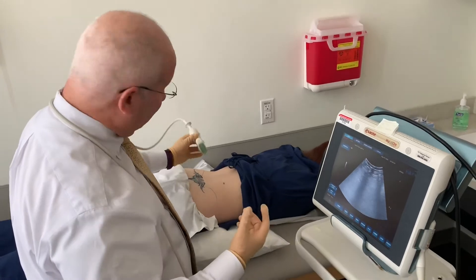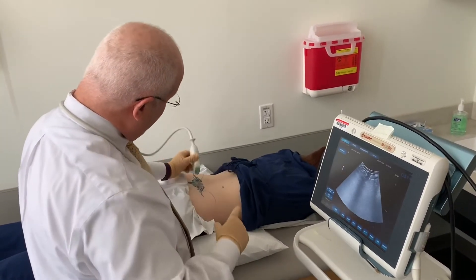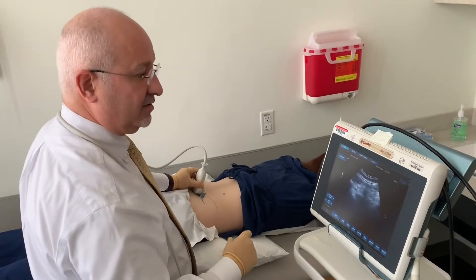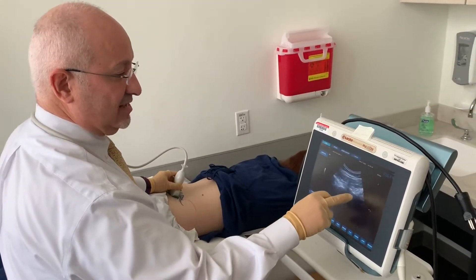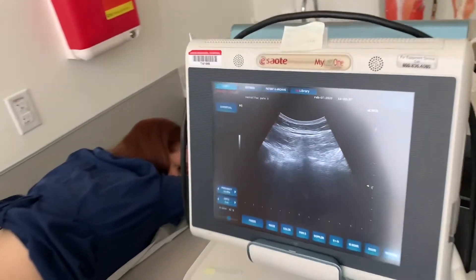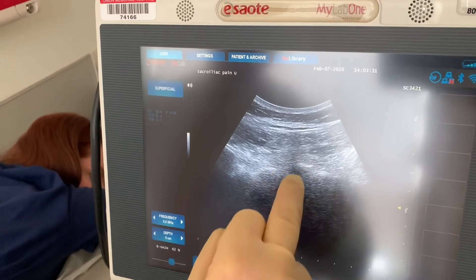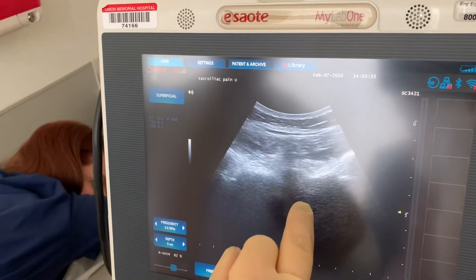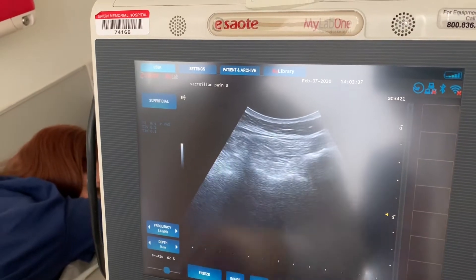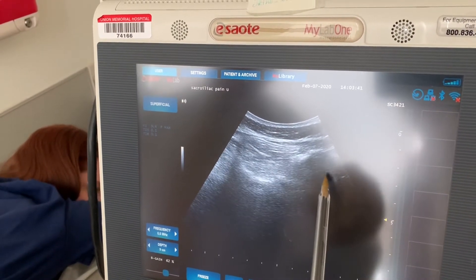For localization, I place the probe in the center. When I look at the image, I can see the sacrum with the spinous processes in the center. If I move laterally, you're going to see the ilium coming into view. That's the ilium here.